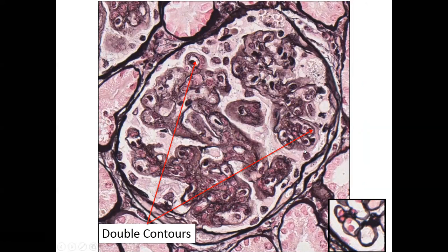If I see this, I say it's consistent with mesangial interpositioning, but in actuality, when I go to EM, it's more frequent to see immune deposits there than the actual small fragments of mesangial cells. But both the mesangial cell interpositioning and immune complexes in that location can cause a double contour appearance. And remember, I've told at least my residents a lot that whenever you do anything to a glomerulus, especially a canine glomerulus, the mesangial cells are the first, the most common reactors. So they start to proliferate and they start to send out these small cytoplasmic projections into the GBM.